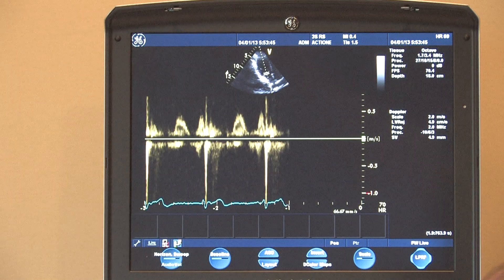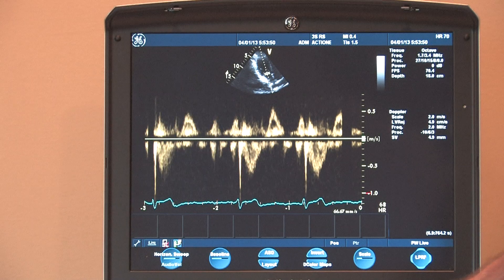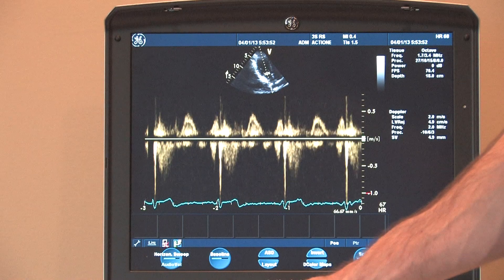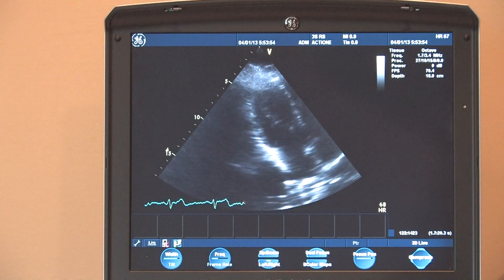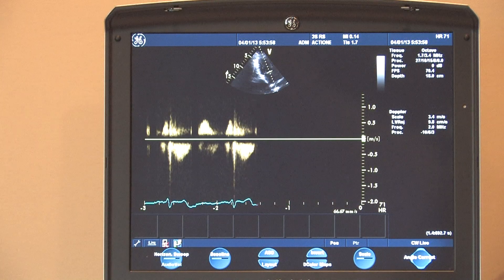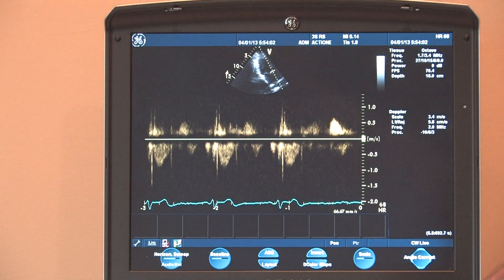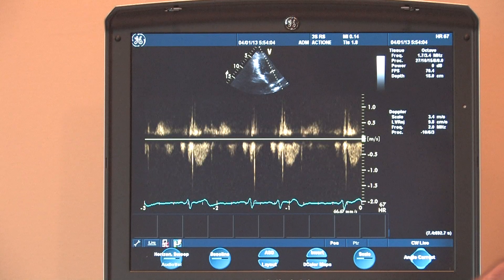The pulse wave function works fine, as does the continuous wave Doppler function. And it all works fine.